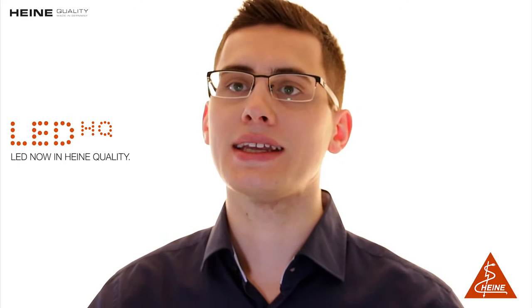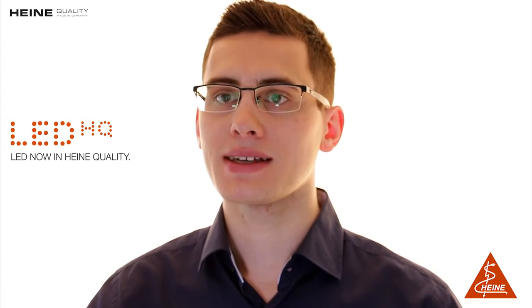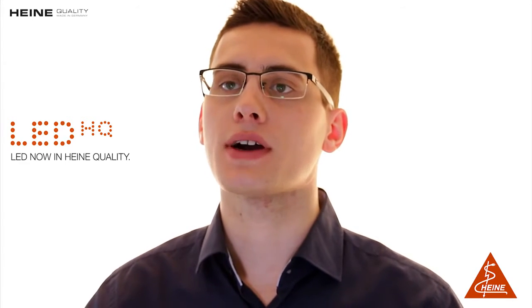Hi, I'm Frederik with Heine and today I would like to talk to you about our ML4 LED headlight. The ML4 LED offers ultra-bright coaxial illumination with LED HQ — LED in Heine quality — the best in durability, performance and function.